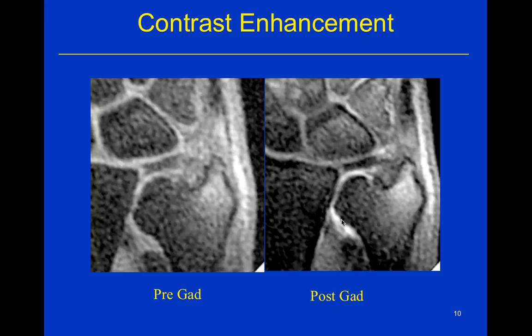The problem is most people don't like to do time intensity curves and do imaging very early on. It takes kind of special techniques, which everybody can do. It's still just kind of a pain to do it. So most people and most of the international criteria for using MR to evaluate joints use the equilibrium phase enhancement, not the early phase enhancement.